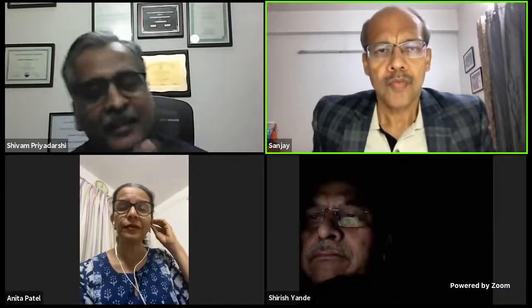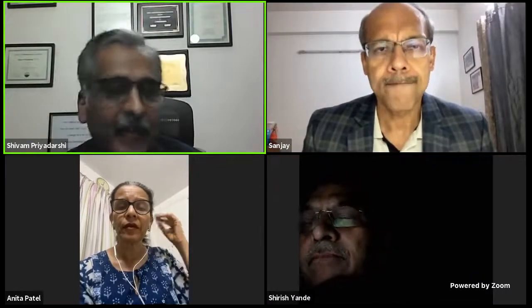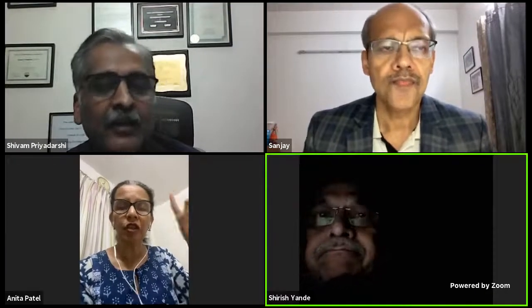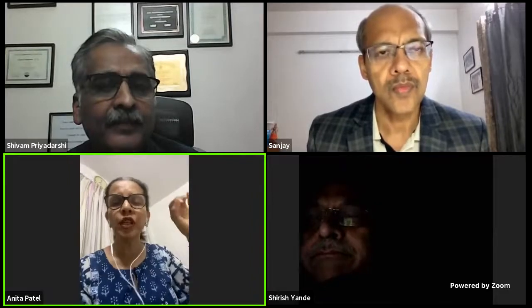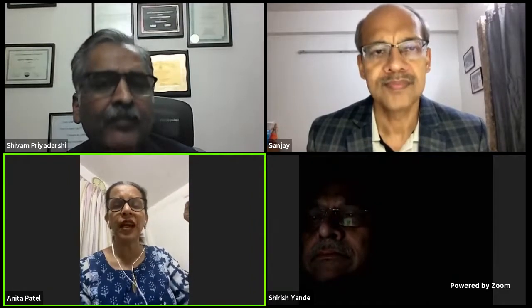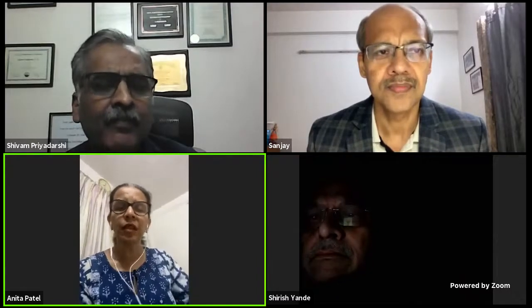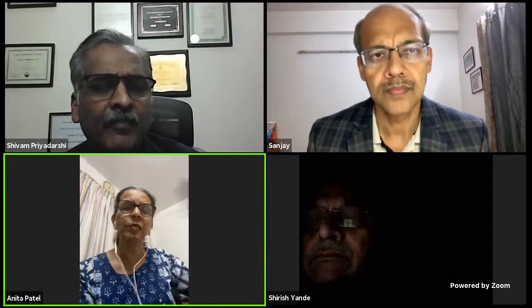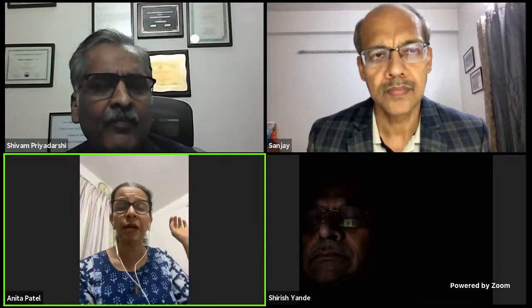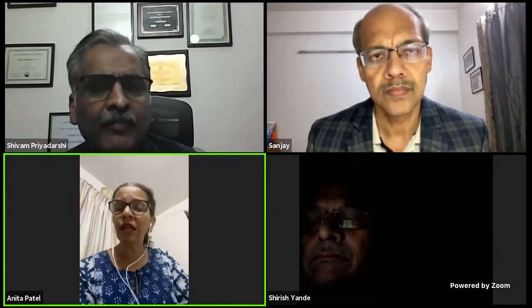Thank you. I think yes. So if you do not have a video, at least have a urodynamics MCU. And the other thing that we also do sometimes is we don't have to have superimposed images of the MCU on the UDS screen. Even if you have the facility of doing a simultaneous cystogram, the two images don't have to be superimposed, as long as somebody is handling the X-ray C-arm and there is a UDS going on simultaneously, as long as the images are correlated with the trace, I think that is all that you need.